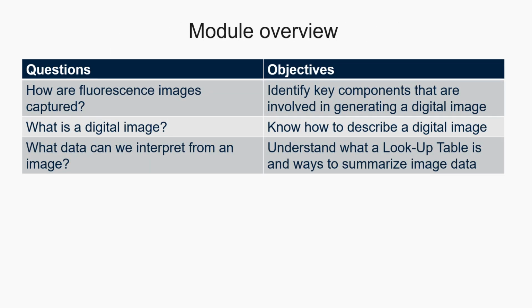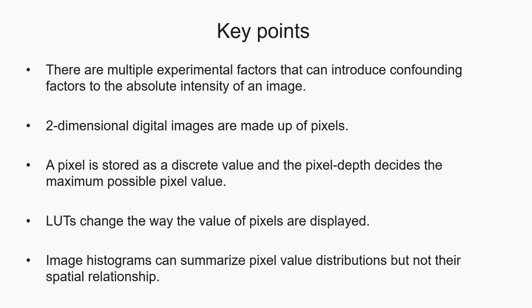Let's revisit our learning objectives. We discussed how fluorescent images are captured through interaction of samples, optics, and detectors. We learned how digital images are organized as arrays of pixels. We also explored LUTs, display settings, and statistics in histograms as tools for understanding image data. These concepts provide the foundation for more advanced image analysis workflows in QuPath.